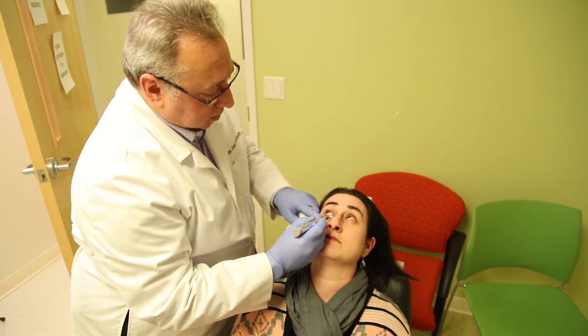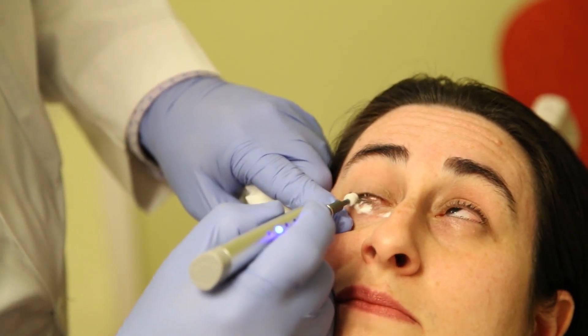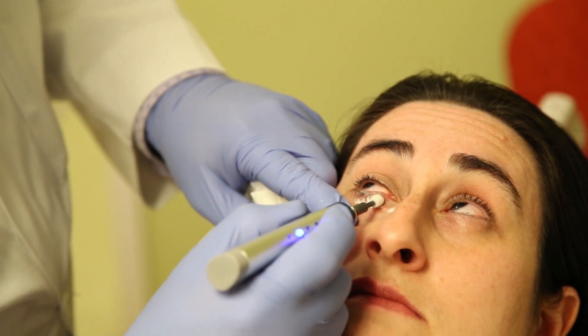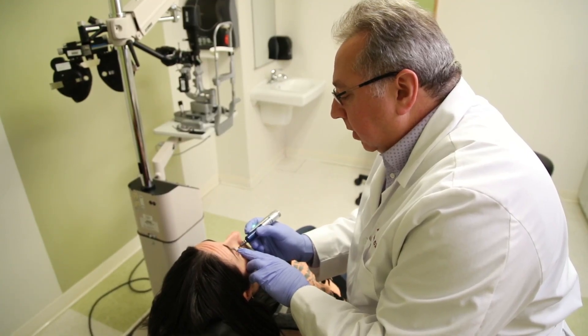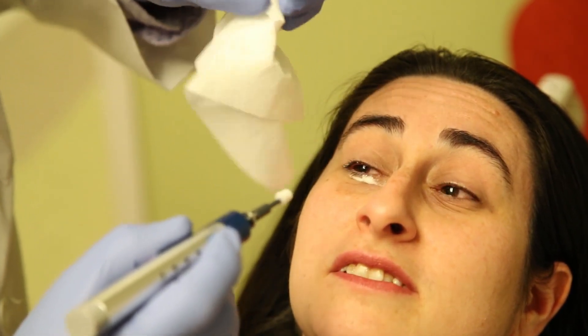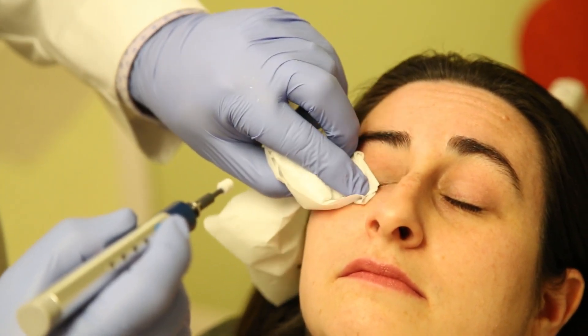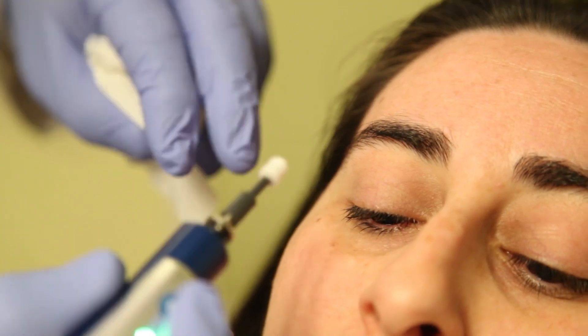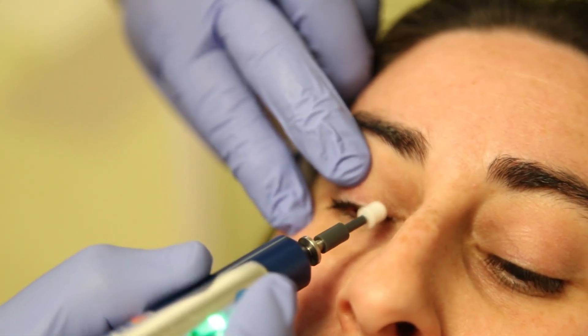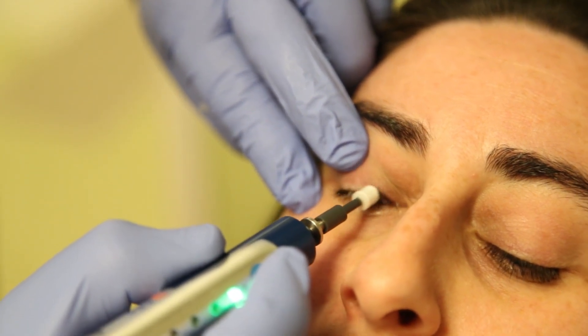Press the power button one more time to access pulse mode and the blue P light will illuminate. Pulse mode allows for treatment of stubborn areas that may persist after treating with forward and reverse modes. During the procedure, if excess foam should build up in or around the eye, ask the patient to gently close their eyes and wipe away the excess with a clean tissue. When the lower outer eyelid is finished, instruct the patient to look down and repeat the procedure on the upper outer lid margin.